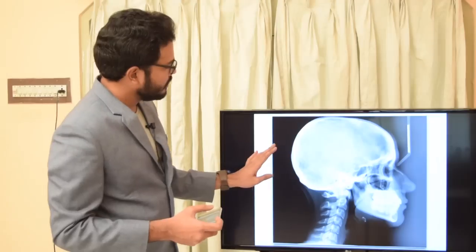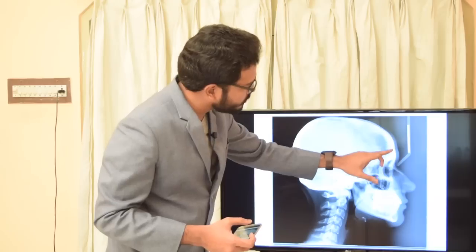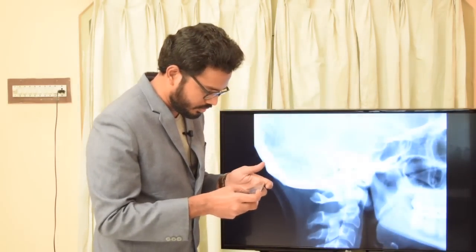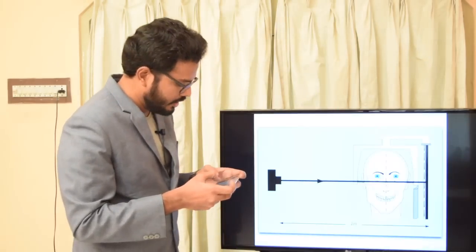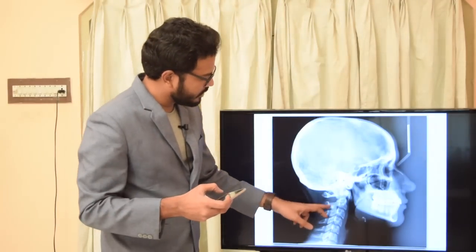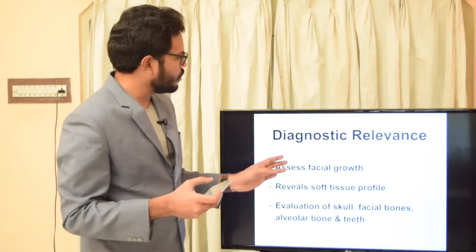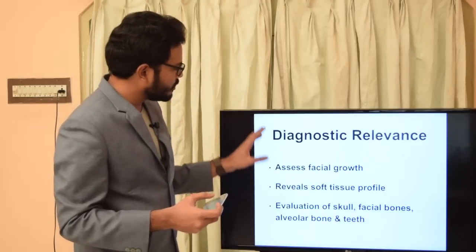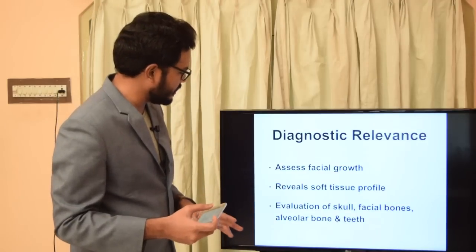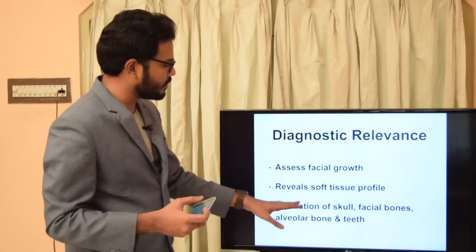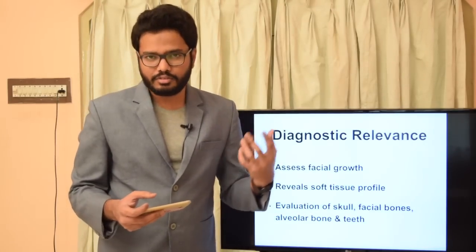This is a lateral ceph where you can clearly see the bones of the skull as well as the face, including a soft tissue profile. You can notice the soft tissue profile evident in this lateral ceph, along with cervical vertebrae, alveolar process of bones, and teeth. The diagnostic relevance is that it's used for assessing facial growth and reveals soft tissue profile.